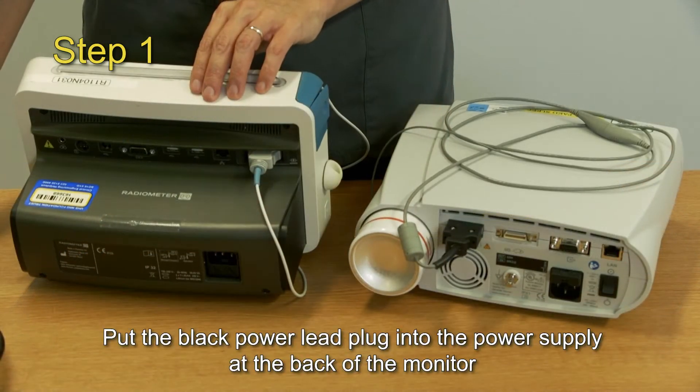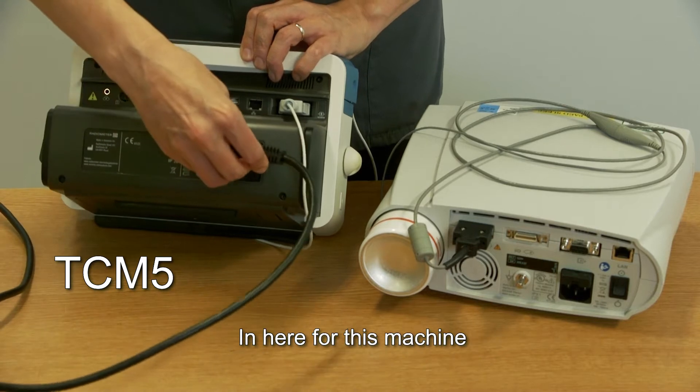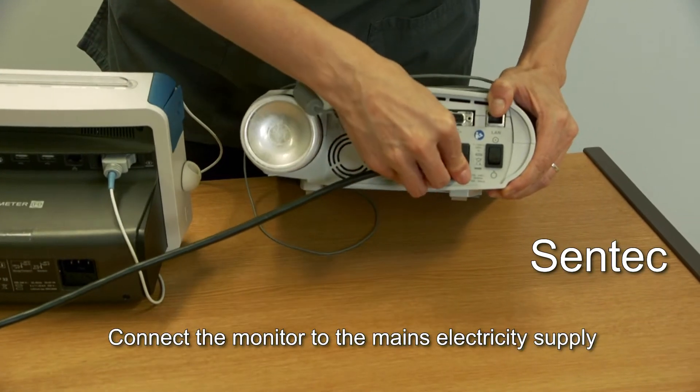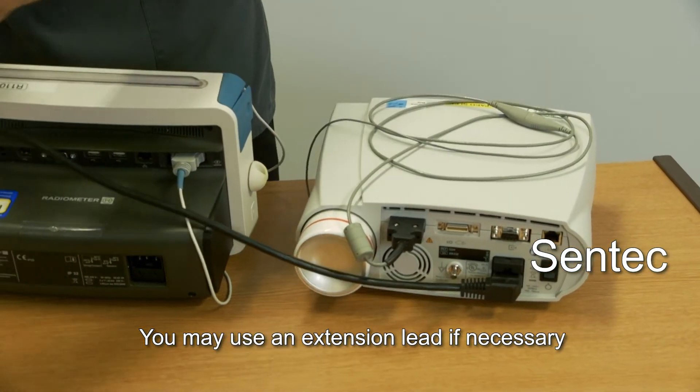Step 1. Put the black power lead plug into the power supply at the back of the monitor — in here for this machine, or in here for this machine. Connect the monitor to the mains electricity supply. You may use an extension lead if necessary.